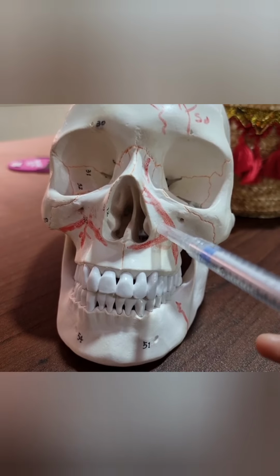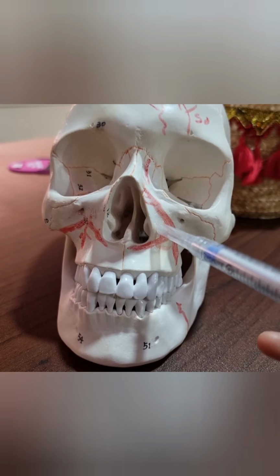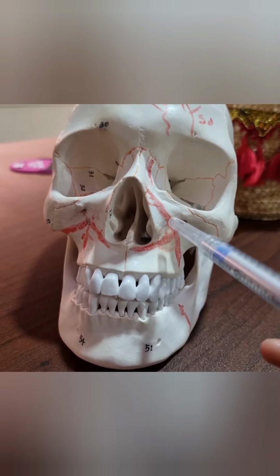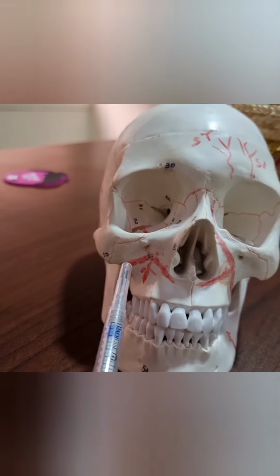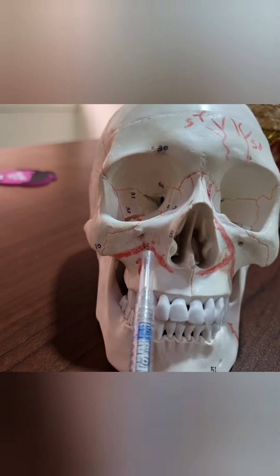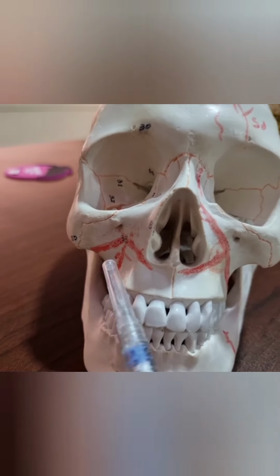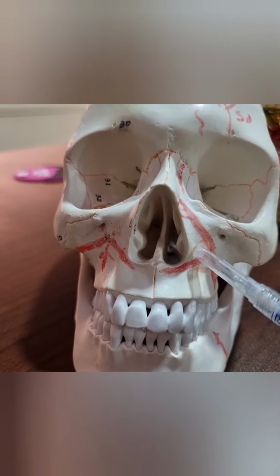Now you are injecting the soft tissue. Yes, you are correcting the cheek, but it's very risky because you may hit the facial artery, or sometimes it's called here the angular artery. And second reason, you are very close to the infraorbital artery, because the infraorbital artery comes from inside, coming out from the infraorbital foramen, and it divides into 3 branches as we know and gives many branches anastomosing with the facial artery. So it's very important to locate your needle and respect the angle of injection.